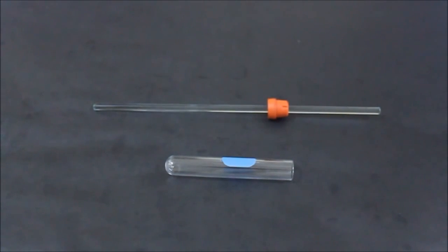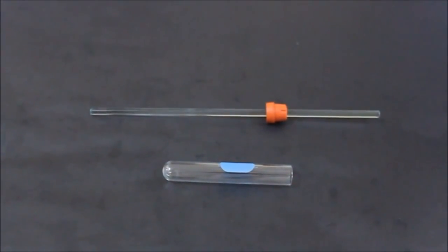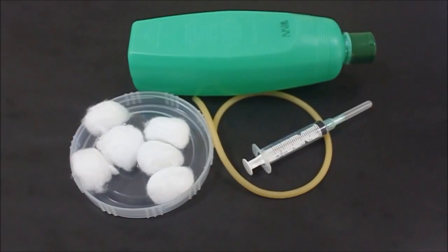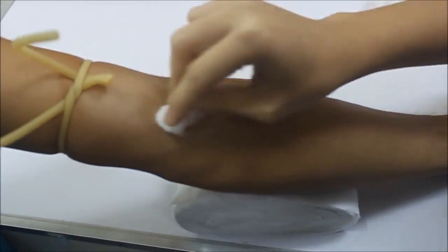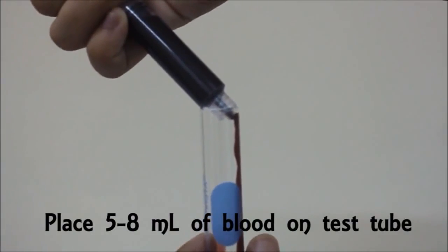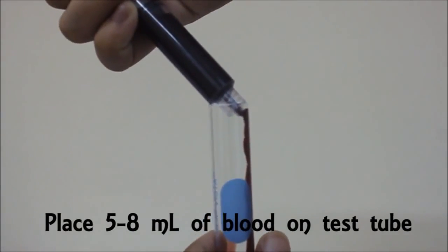Clot retraction time is the time required for blood to shrink. The materials needed for the McFarland modification are test tube, stirring rod fitted into a cork, test tube rack, and materials for venipuncture. To begin, collect blood by venipuncture. Place 5 to 8 ml of blood in a clean test tube.